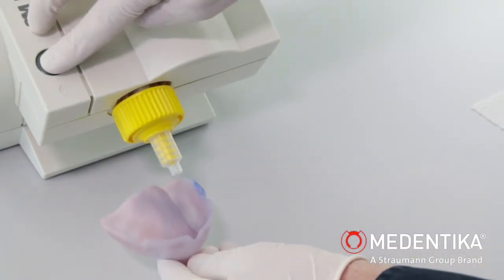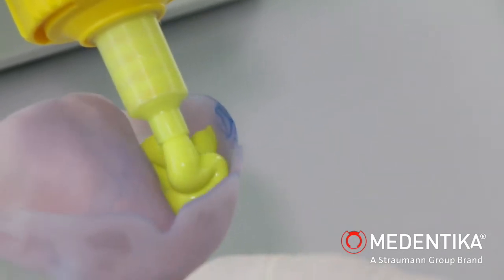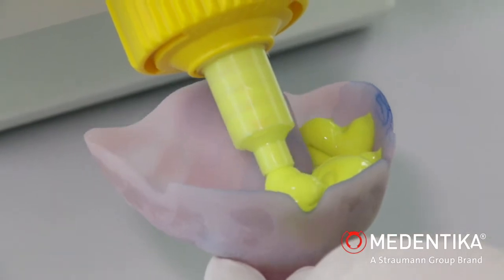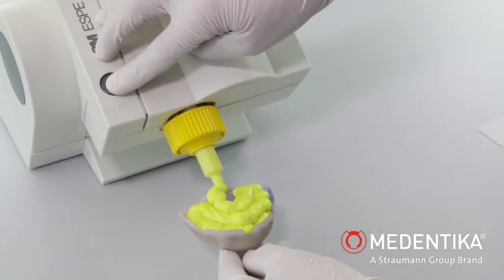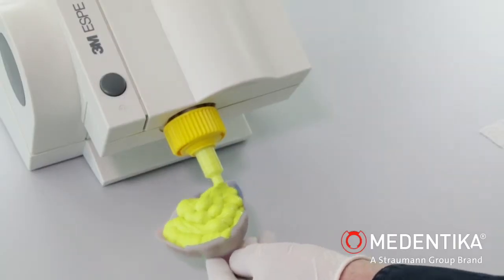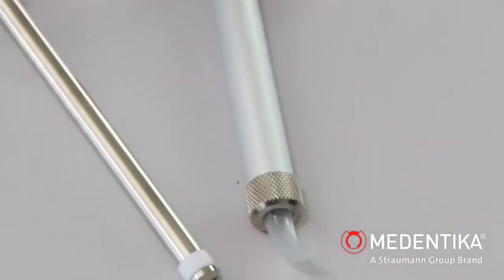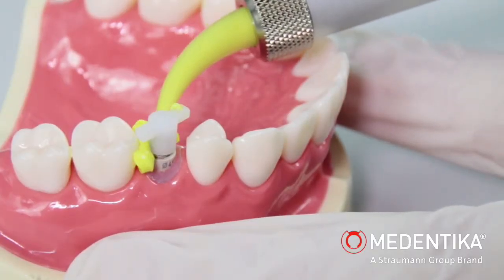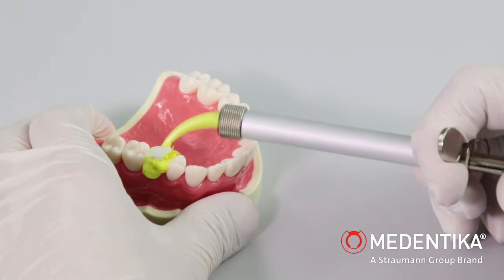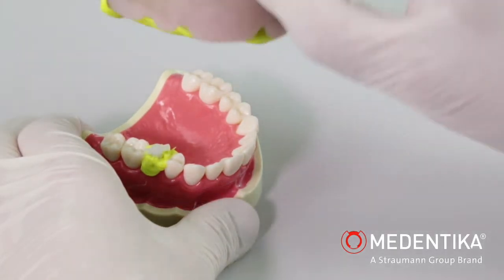The custom tray and elastomer syringe are loaded with the aid of a mixing unit. The space around the implant pickup and positioning cap is completely filled using the elastomer syringe. The impression is then taken using the tray.